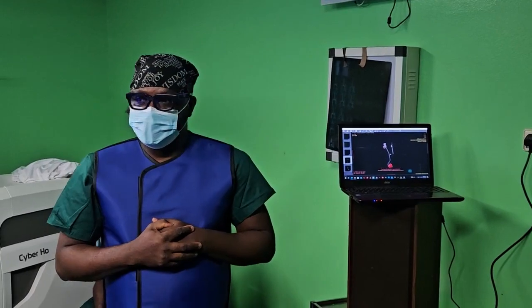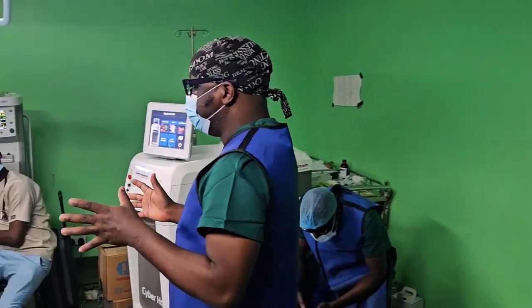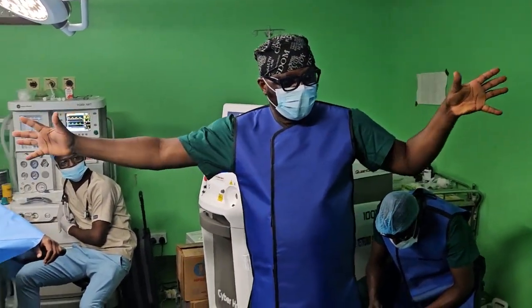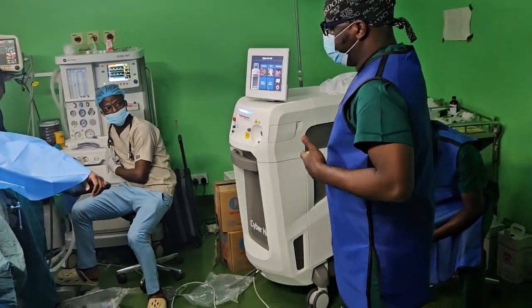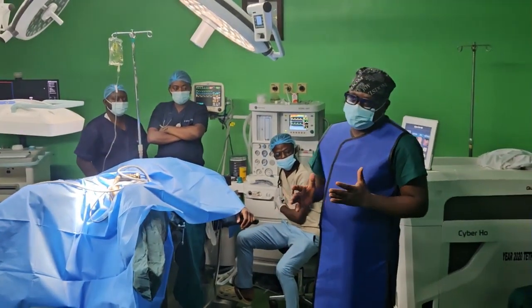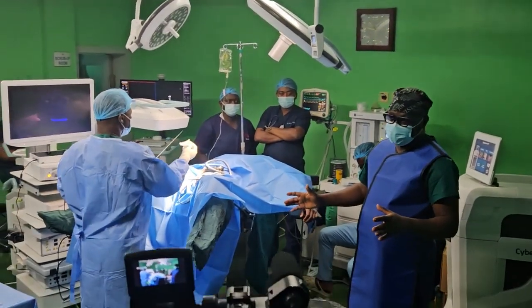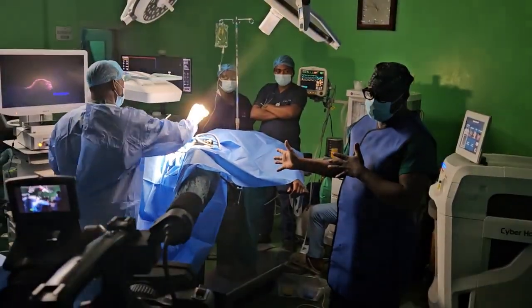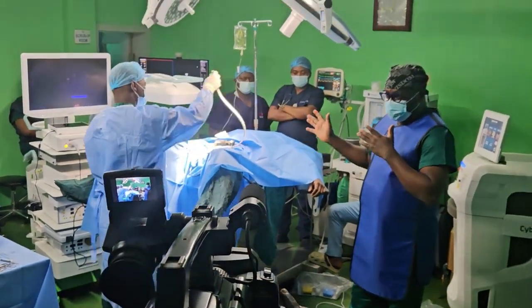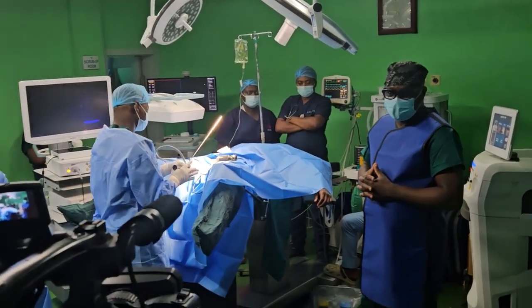Thank you very much. So let's run through the theater setup. We saw that. Please give us a panoramic view, a wide, broad view. Most key opinion leaders will agree on the first stage of the procedure, because I'm describing prone, there is supine and all of that. So I'm doing prone mini PCNL, with possible prone endoscopic combined intrarenal surgery.